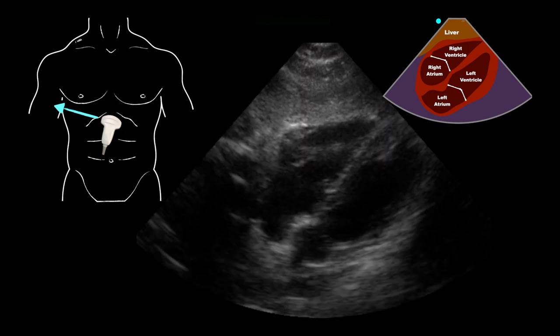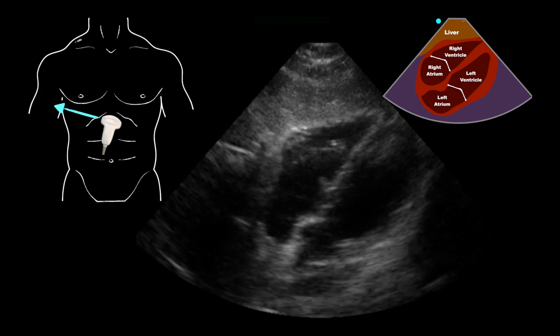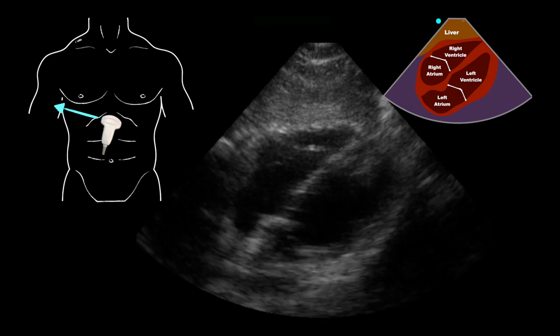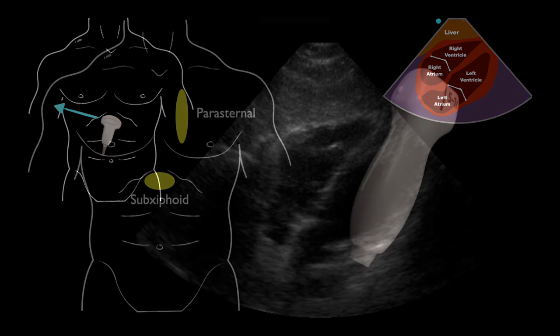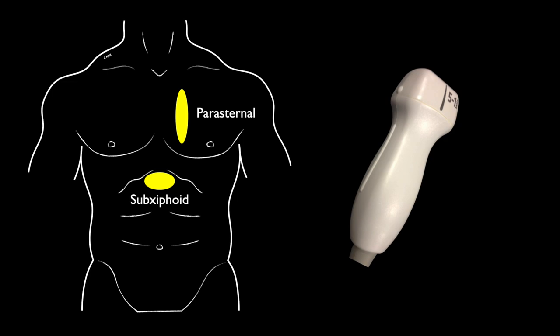We can see the inner walls of the left ventricle close down well — this is a normal appearing ejection fraction. If you want to learn more about cardiac ultrasound, a link is included in the corner. If the sub-xiphoid view is not obtainable, we do have the option of doing a parasternal view, and I'd recommend switching to a phased array probe. I'd typically save that until after finishing the rest of the abdomen, as changing probes takes about 30 seconds each time.